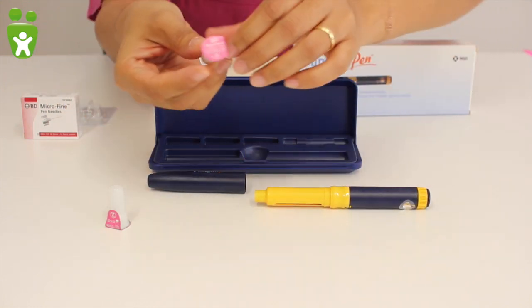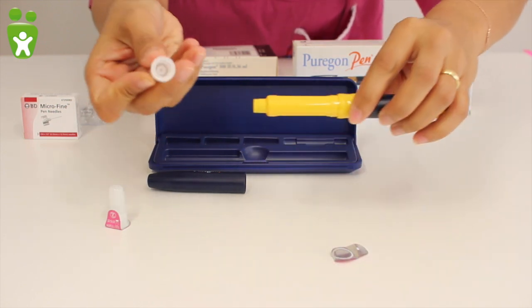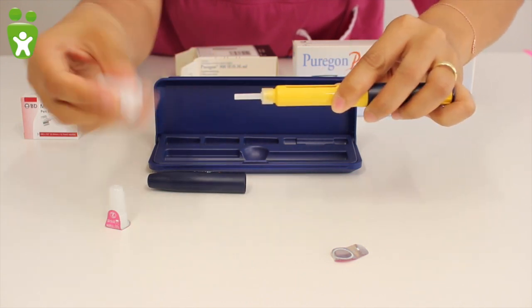The injection needle, which should be changed daily, is screwed on clockwise. The protective caps are then removed until the needle is exposed.